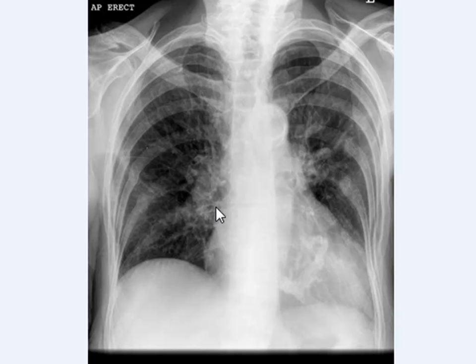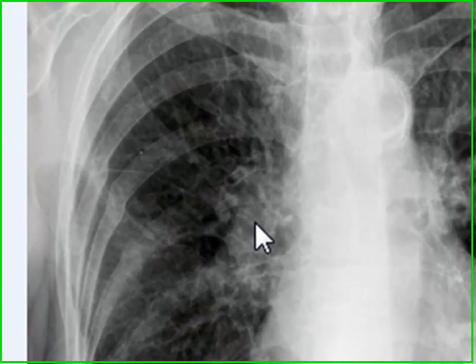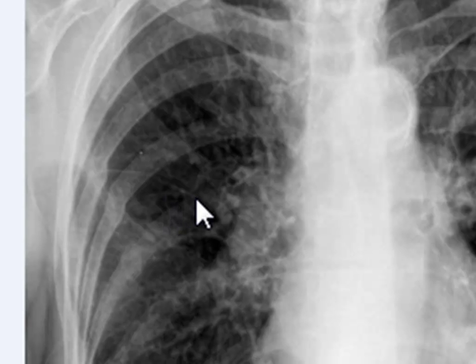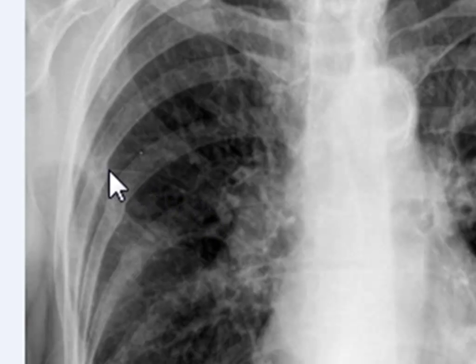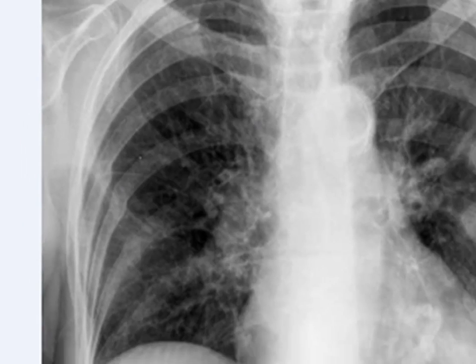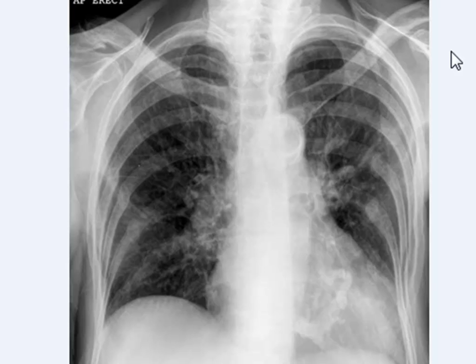Hello everybody. We have seen this chest X-ray before, at least twice in two other videos. Today I want you to pay attention to this very thin horizontal opaque line — well, almost horizontal — which is starting from here and moving towards the lateral chest wall, finishing up here. This is the horizontal fissure, some people call it the transverse fissure.